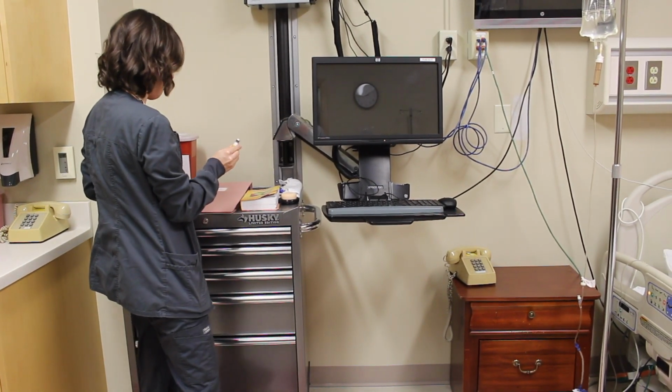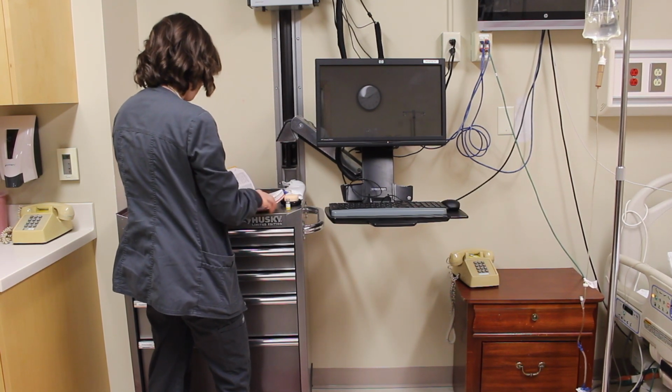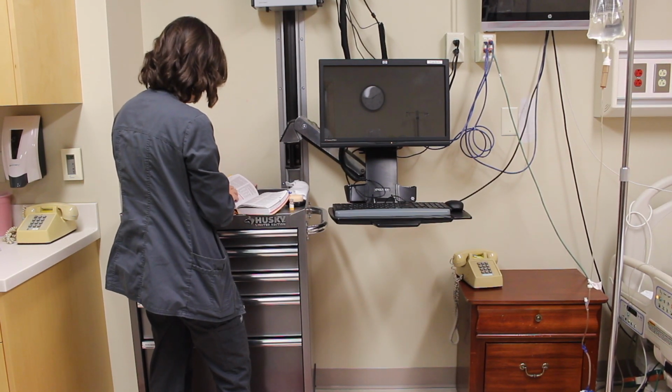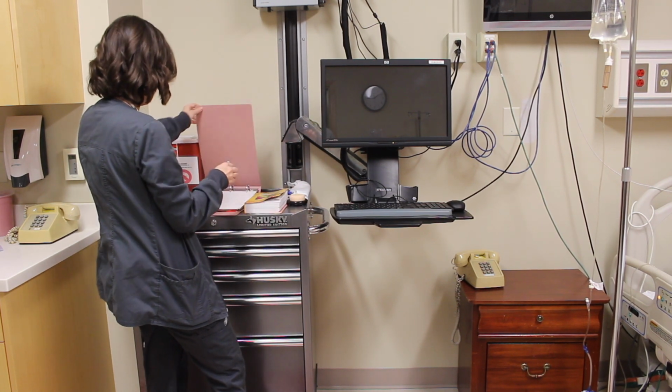Determine how fast the medication may be administered. This is known as the IV push rate. This can be found in the drug guide. Also determine if the medication needs to be diluted prior to administration. Prepare the medication from a vial or an ampule. Dilute as needed.